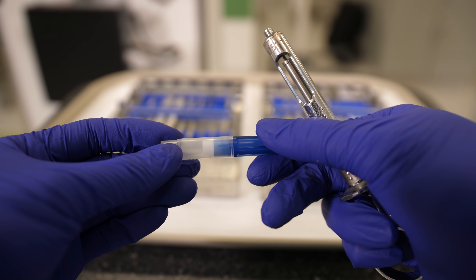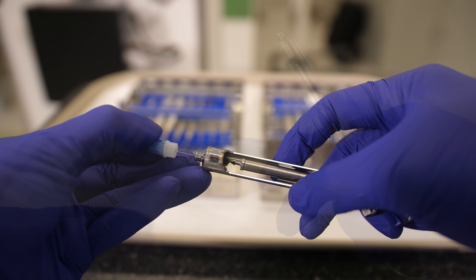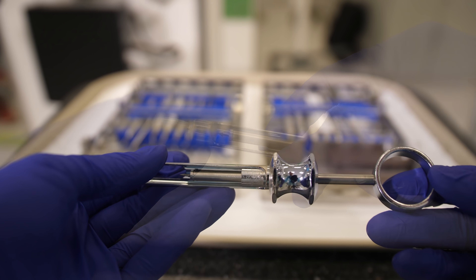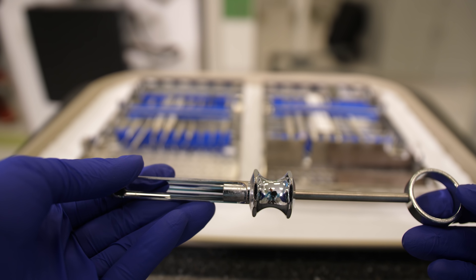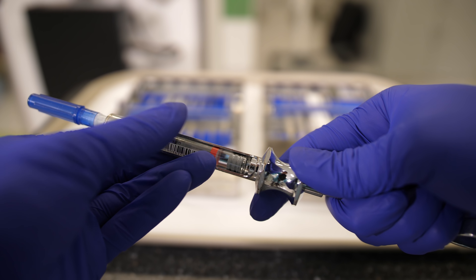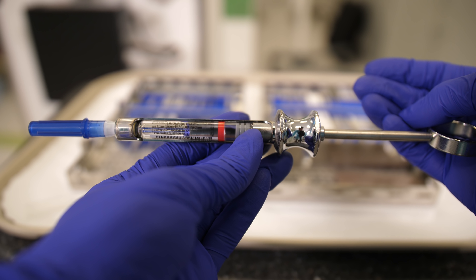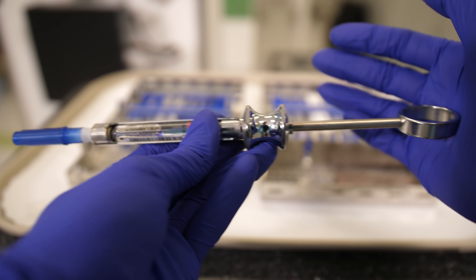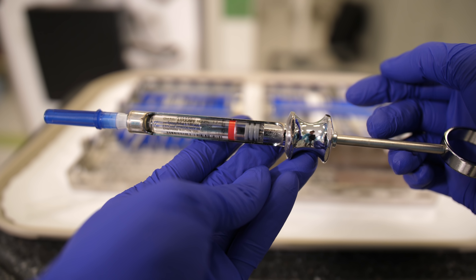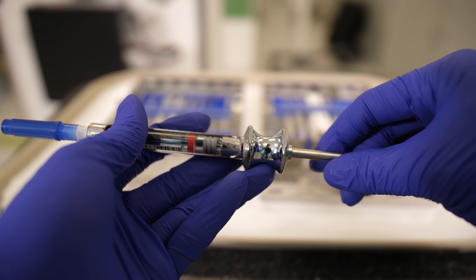To set up the syringe, twist off the clear end of the needle and insert the needle into the syringe. Pull back the syringe and place an anesthetic cartridge into the barrel, rubber stopper side contacting the harpoon. Be careful not to bend the needle upon insertion of the cartridge. Give the syringe a firm tap to engage the rubber stopper.